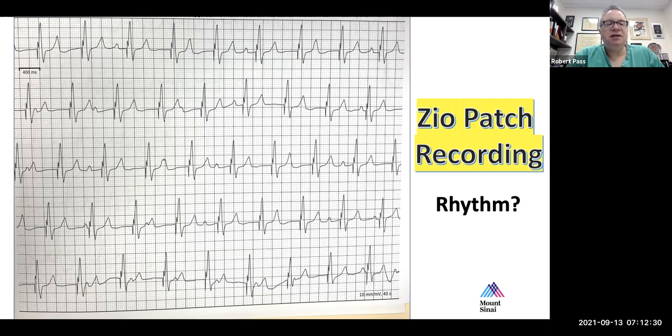Another interesting observation about this patient was that despite the fact that there was a rate responsive feature on the device, and remember that pacemakers have a rate responsive feature you can turn on, which can detect motion and slowly raise the heart rate, similar to what would be expected from a person's own intrinsic adrenergic tone. And yet, despite the fact that it was on, this patient is paced 100% of the time at a rate of 70, showing that the rate responsive feature on these devices can be very insensitive. Now, in her particular case, the device is in her abdomen. And it has been my experience that when the device is in the abdomen, that particularly results in very little rate responsiveness.